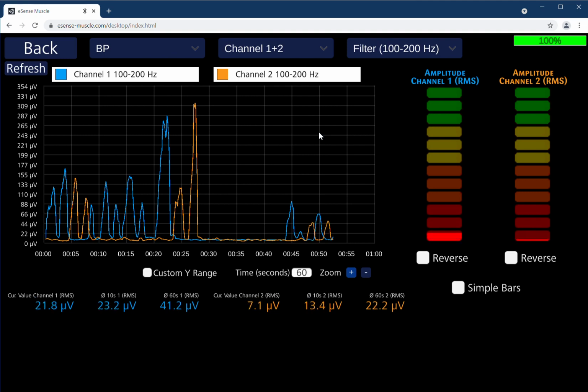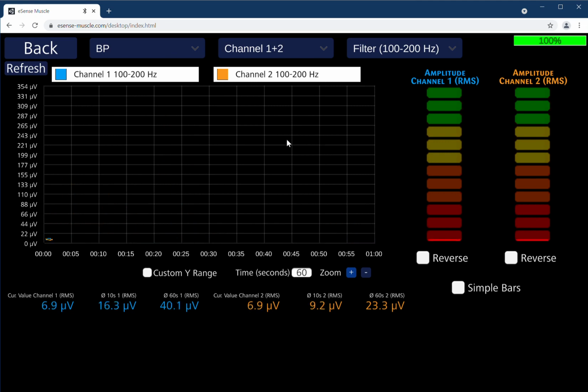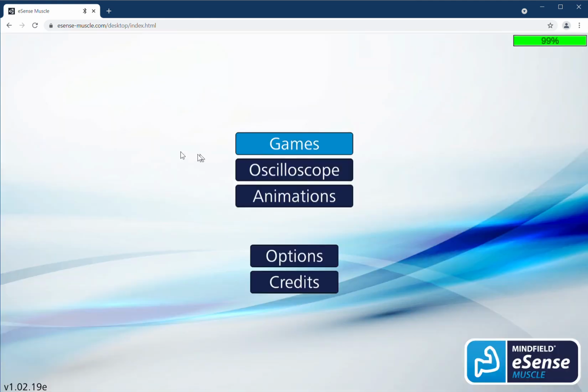Then maybe you will also have this oscilloscope view that is pretty usual and can be used to demonstrate the muscle activity and also used to do some training. We will add some more functionality here, some pattern training where the user needs to follow a pattern that you can draw here with a line to make a specific movement, for example. Okay, so this is the oscilloscope for now. Let's go back and have a look at the animations.